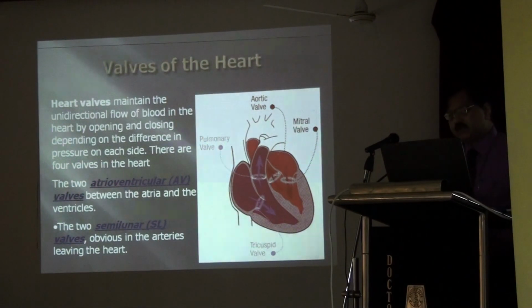Echo basically relates to the structural and functional abilities of the heart, including the anatomical different views of the valves, wall motion, chamber size, pericardium, and pressure gradient. These are the 5-6 parameters we always have to concentrate on. Heart valves, you know, are the most important. Two groups of valves are the atrioventricular and semilunar valves.